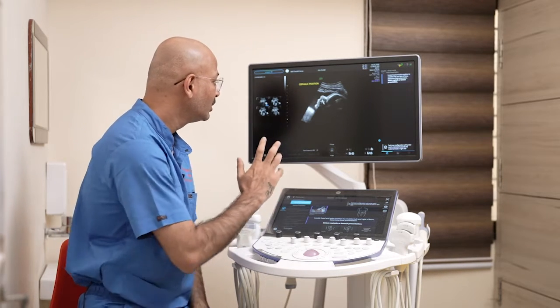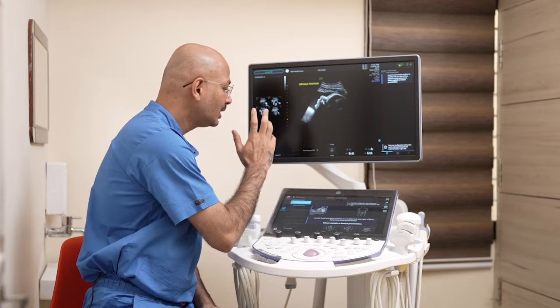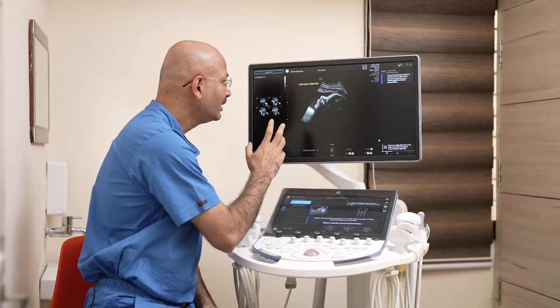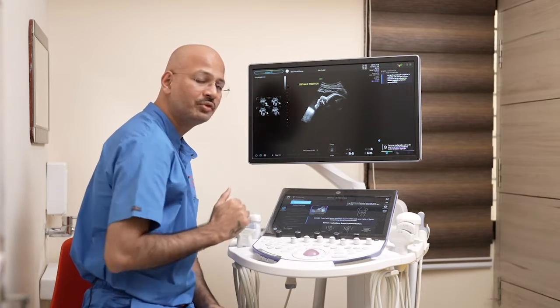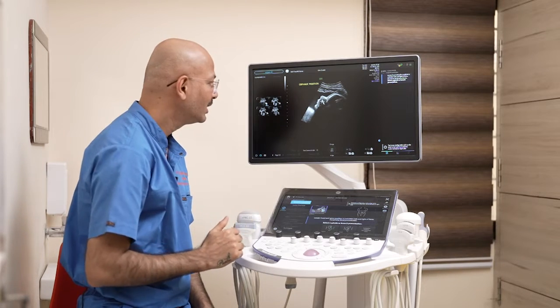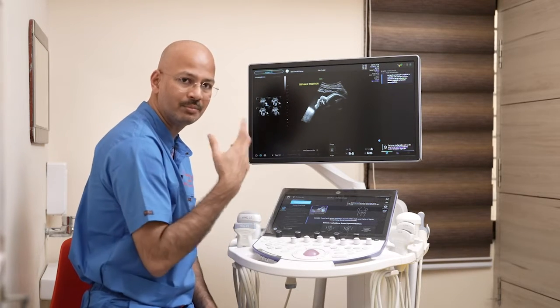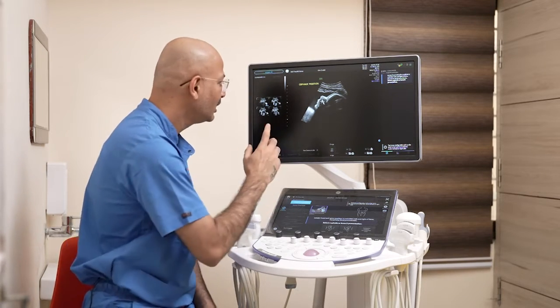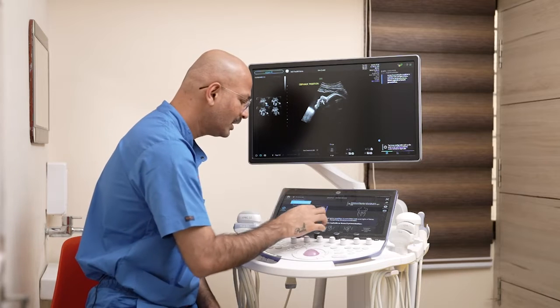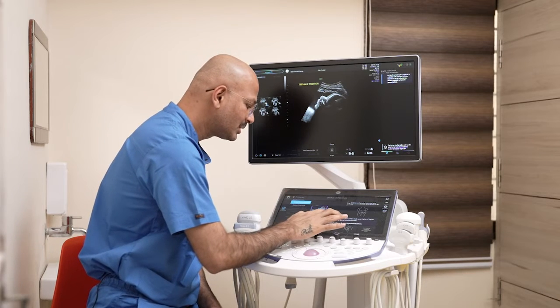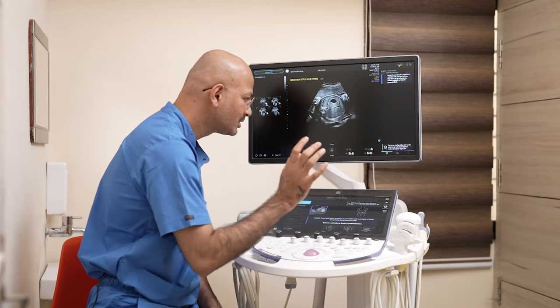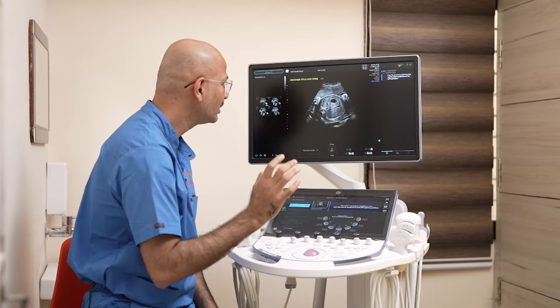First, you have to assign the fetal position — whether it is cephalic or breech. Here it is cephalic, so I'm just clicking on cephalic position.